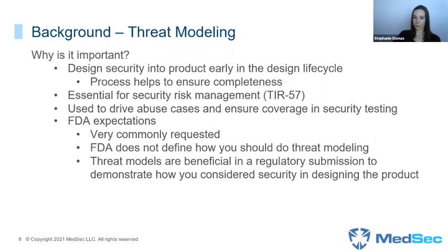There's the ability to drive abuse cases and ensure coverage into your security testing. And it is very commonly requested in FDA submissions. We work with a lot of customers who are working on their submissions, and I can tell you this is a very, very common ask: if you do not provide them with a threat model, they are going to ask you for a threat model. The FDA, however, does not define exactly what you need to do. They basically want to see that you've done something that passes muster. So we're going to talk to you about some industry-respected techniques, but more importantly, how you actually integrate that into your regulated process.